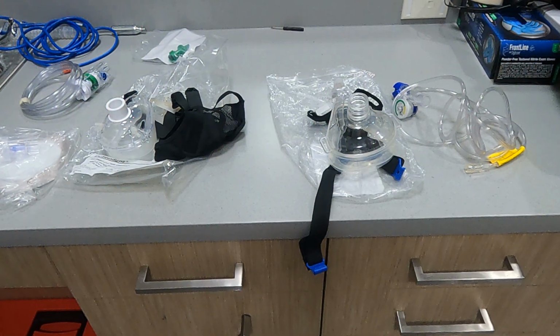Alright everyone, in this video we are going to talk about CPAP. CPAP stands for Continuous Positive Airway Pressure. So when you think to yourself, I've heard of positive pressure before, we've talked about it when we talk about BVM ventilations. BVM ventilations deliver positive pressure when you squeeze the bag. CPAP delivers positive pressure continuously, both on the patient's inhale and on the patient's exhale.